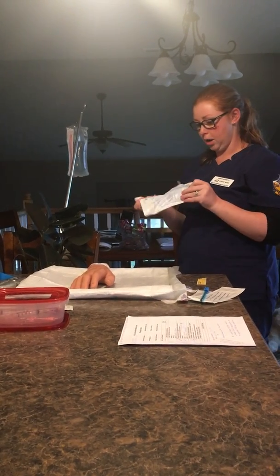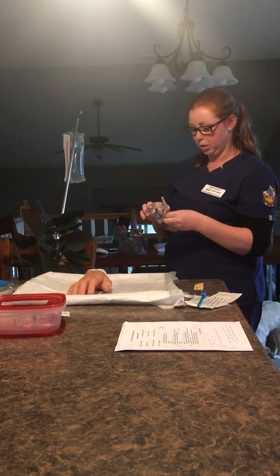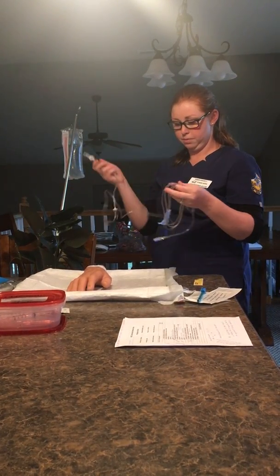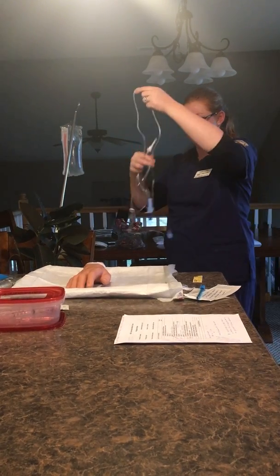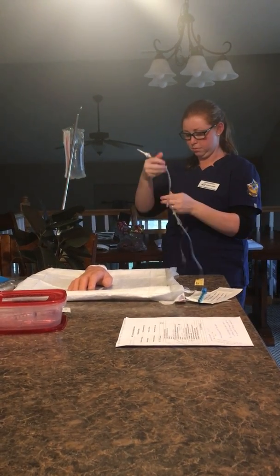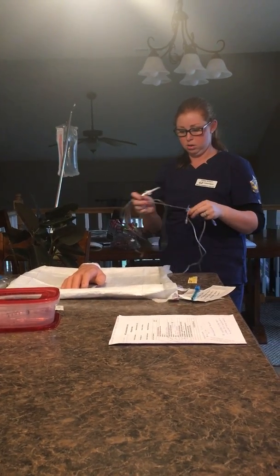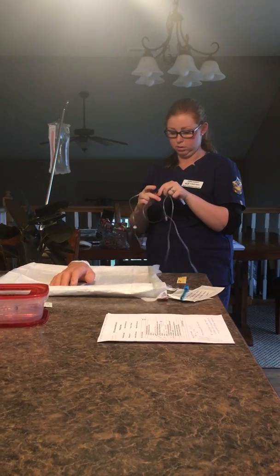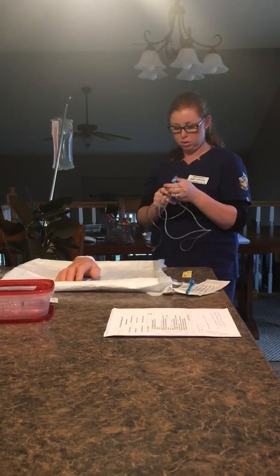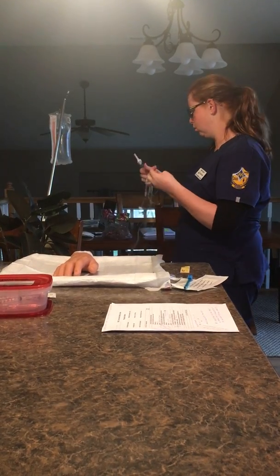And then I'm going to go ahead and get my tubing set up. The biggest thing with this tubing is just making sure that you maintain the sterility of the ends. So with this, I'm gonna make sure that I have my tubing clamp so it doesn't drip everywhere after I spike it. Make sure my valve is closed.